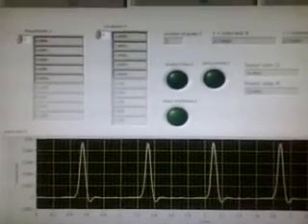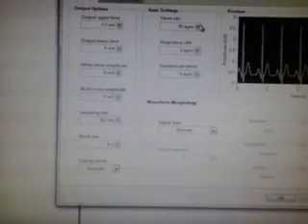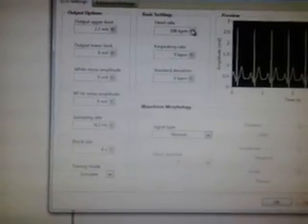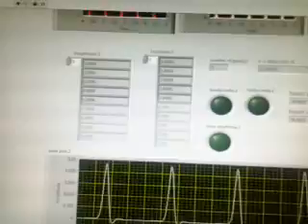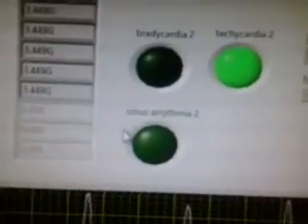So for showing the working of the server, we take the simulator and increase the heart rate somewhere around above 100 to get the tachycardia. I have taken it as heart rate 106 BPM. Okay, now run this part. See the server, it indicates the tachycardia.